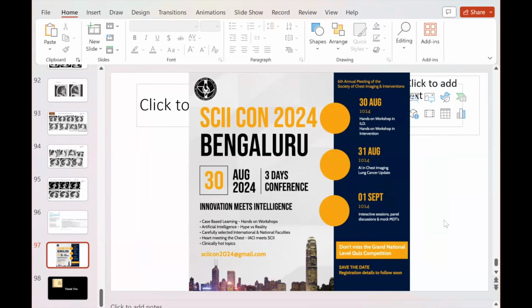One thing from my side I want to add. Whenever in children, we tend not to do the contrast studies, and then we miss a lot of things, like we miss nodes, and there may be other anomalous vessels. So best is to do a contrast study right away. Delaying the contrast study is going to delay a lot of the diagnosis, and we don't have to do multiple phases. We don't need plain, arterial, venous, etc. We just need one good contrast study with good contrast in all the vessels, which we can easily achieve now with all the machines that we have.